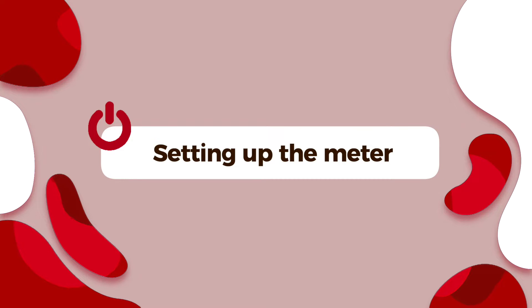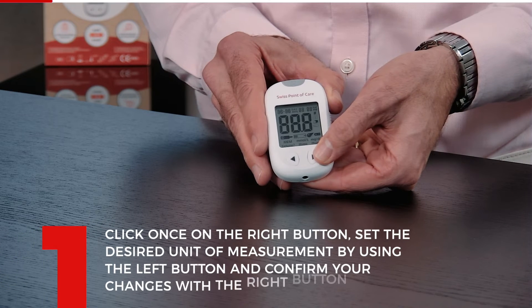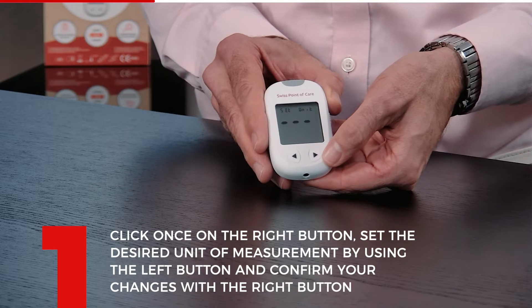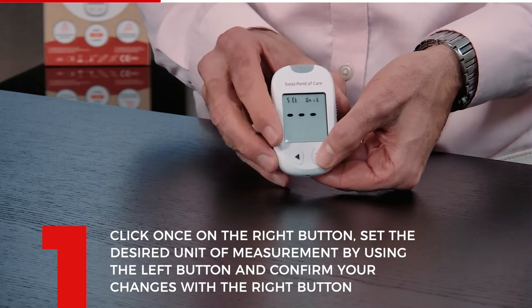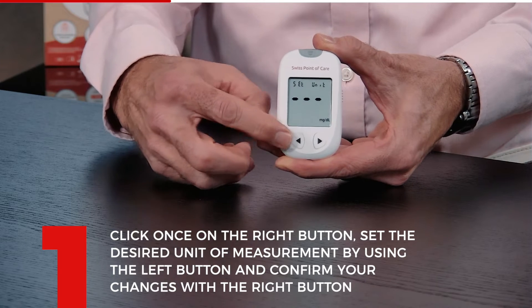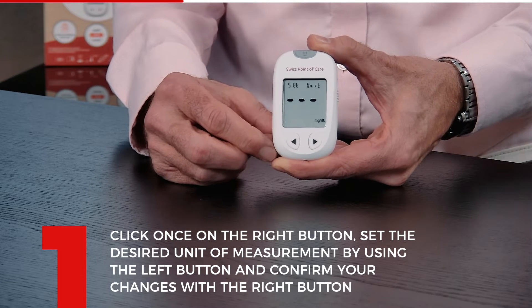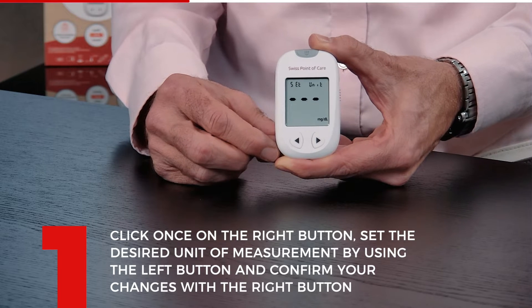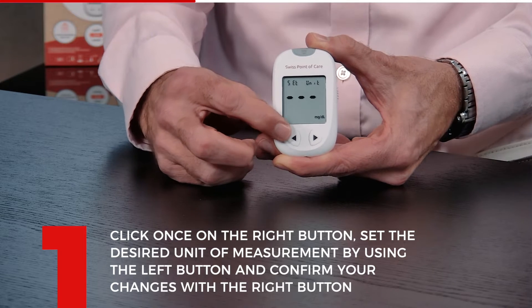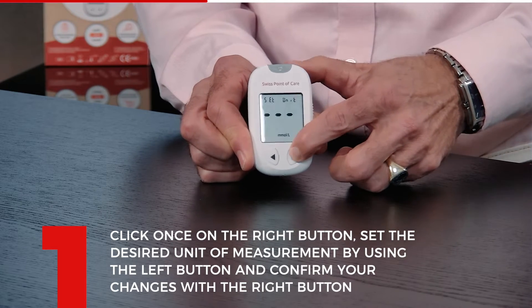Now I'm going to show you how to set up the meter. Now that the batteries are in, turn on the meter. The first thing it will ask you is to set it up — you have to choose the unit. You do that by choosing millimole or milligram. If you don't know what to use, look on our website. Millimole is mostly used in the Netherlands; milligram is more used in Germany. It depends on the country and what you're used to. Right now I'm going to put it on millimole and press confirm. And now it's set.